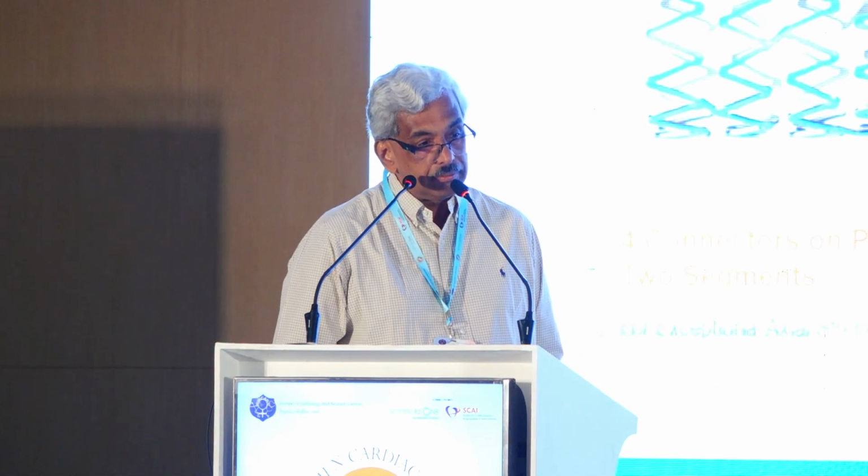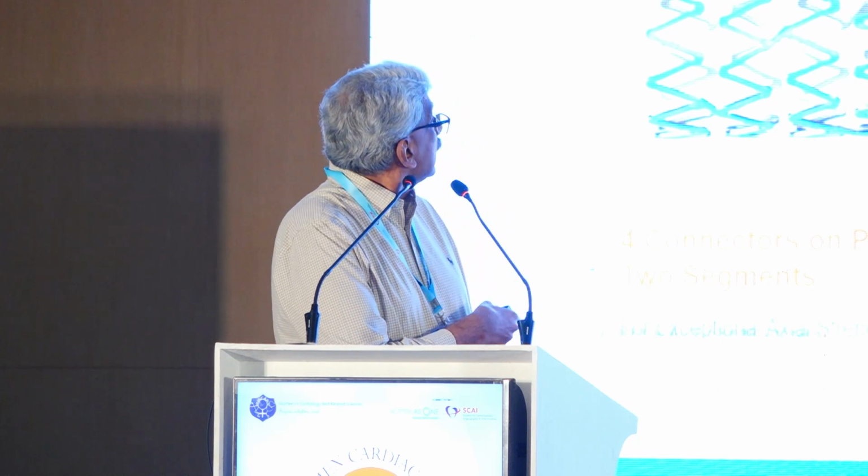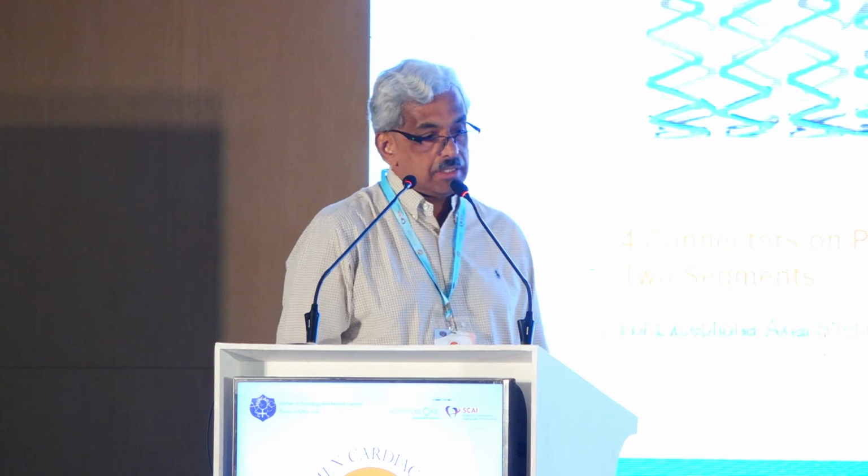Now this is the new kid on the block, and I just want to say that I have not used it, but some people in India have used it. But what I want to ask you to look at very carefully is the design. First thing, it's got a strong radial strength related to two issues. One is a 12-peak design with short struts. This makes the radial strength very, very good. There are 4 connectors on the proximal segment.